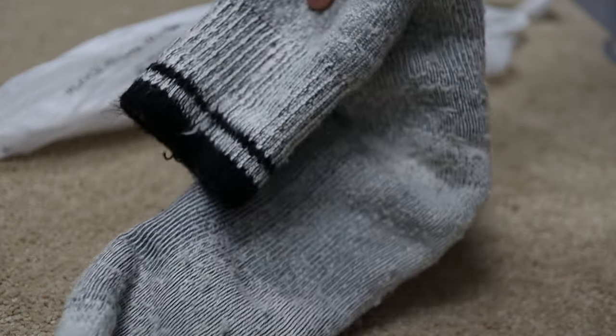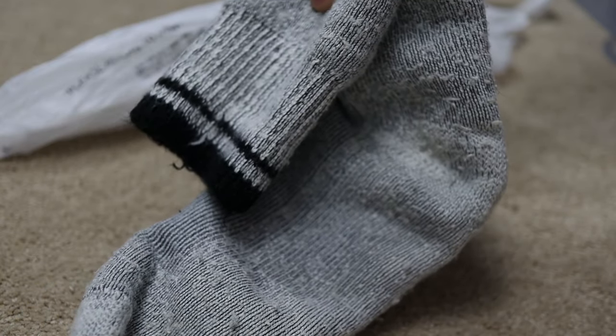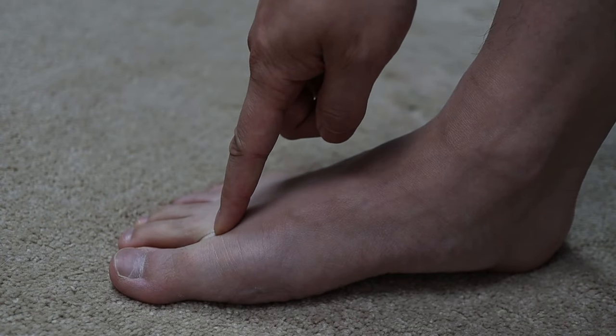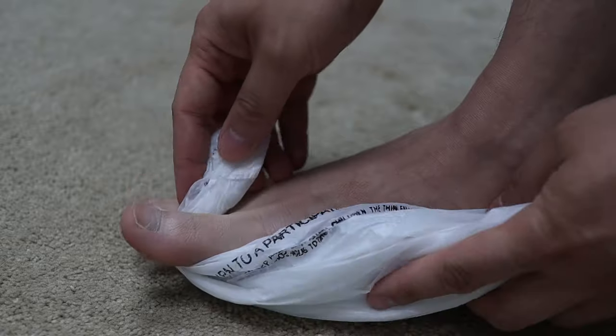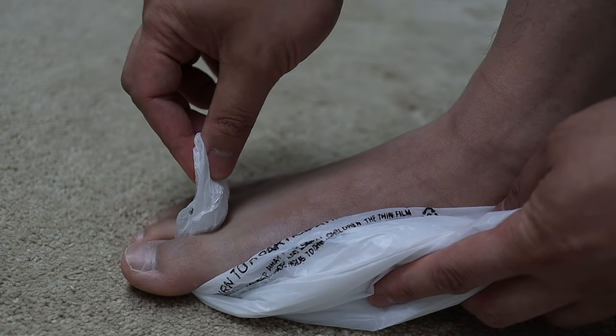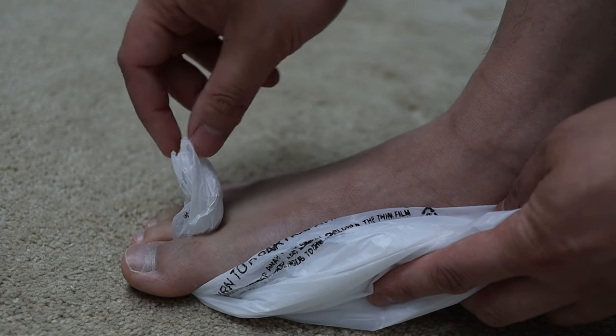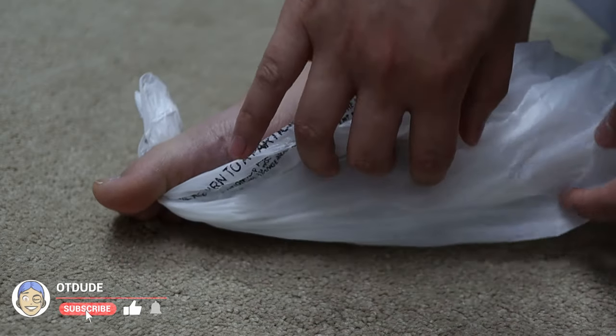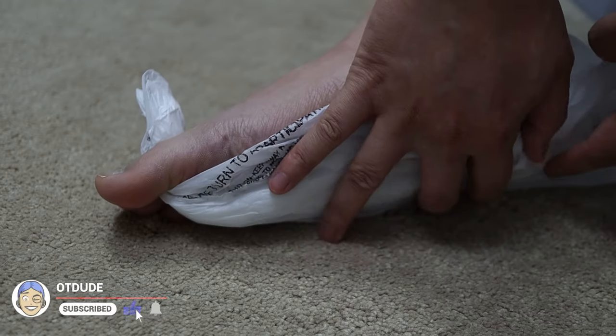This trick only requires two items: a pair of compression stockings and a plastic bag. Place the plastic bag between the big toe and the second toe. Be sure to leave about two inches of extra plastic bag at the top — you don't want to leave any more than that because it'll make it difficult to remove later. Make sure that enough plastic covers the bottom of the foot, and spread it out if needed.